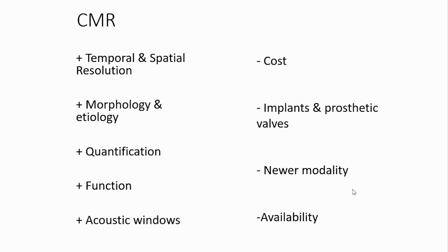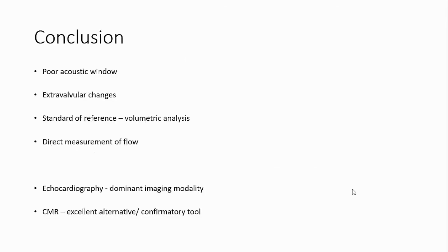With limitations of it being costlier, newer modality, less available compared to echocardiography, and patients with implants and prosthetic valves might show artifacts while scanning.